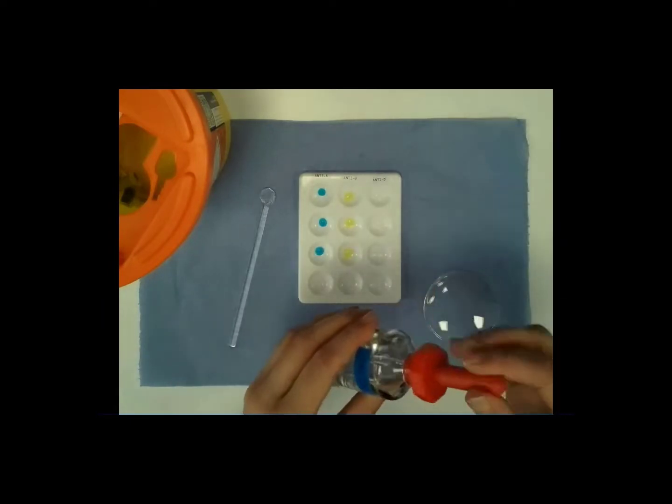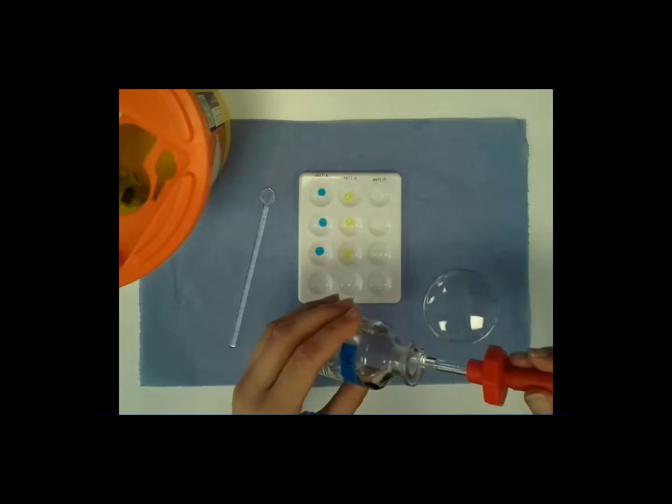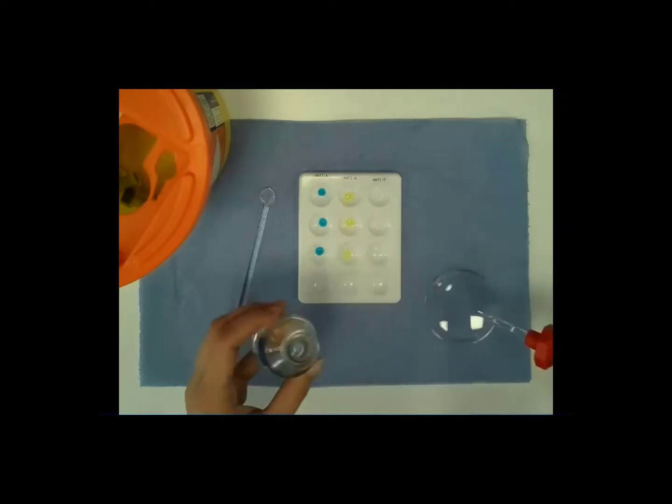Now we need to set up the watch glass so that we can dilute our blood sample. Take the saline and add 15 drops to the watch glass. This will be enough to dilute your blood sample and give you enough fluid to add to each of the 9 wells on the plate.